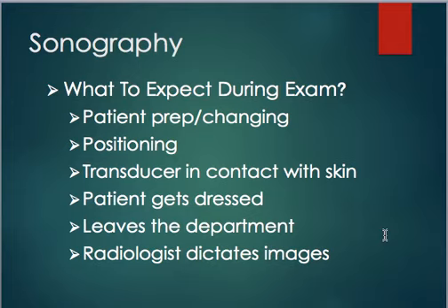Sometimes the technologist will go and talk to the radiologist prior to the patient leaving, but if they don't, the patient will just get dressed and leave the department. After the sonographer is all done with their images, they'll send them off to the radiologist, and the radiologist is going to go through and dictate those images and send a final report to the doctor.